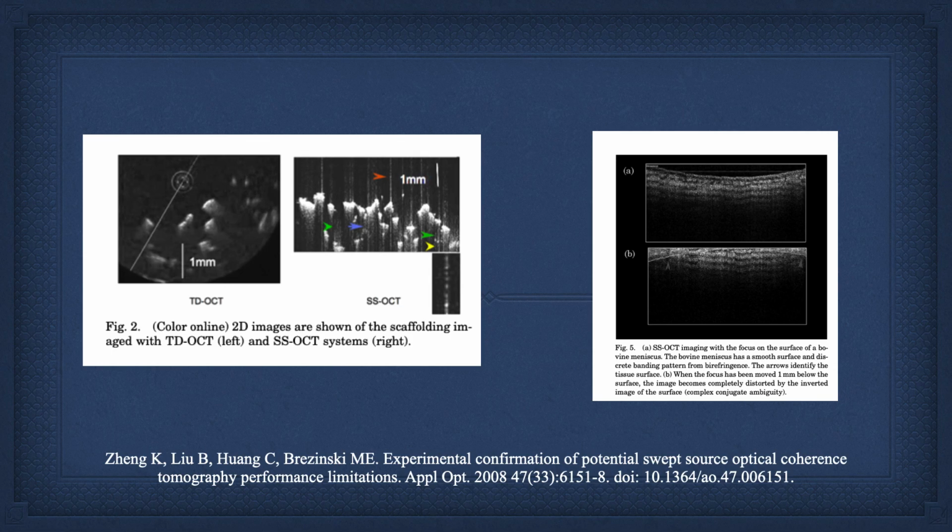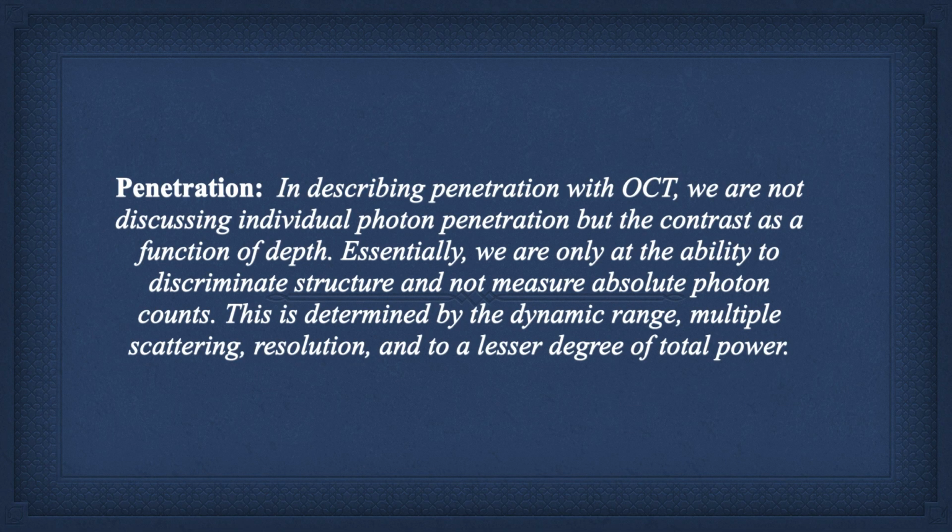And that doesn't happen with time domain. It has to do with the mathematical conversion. It's part of the reconstruction process, and it's inherent to these Fourier-based techniques.